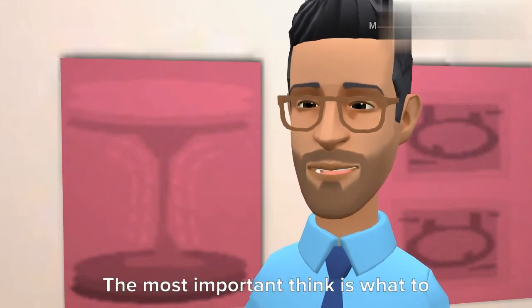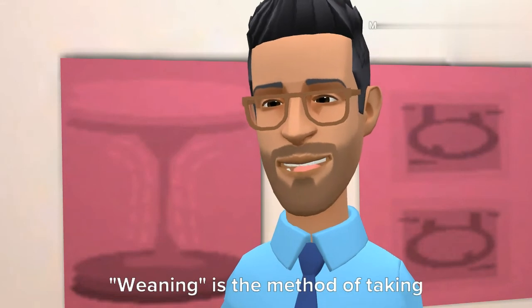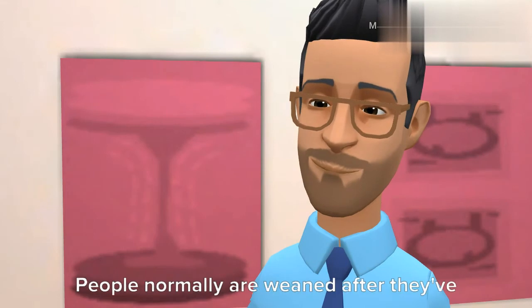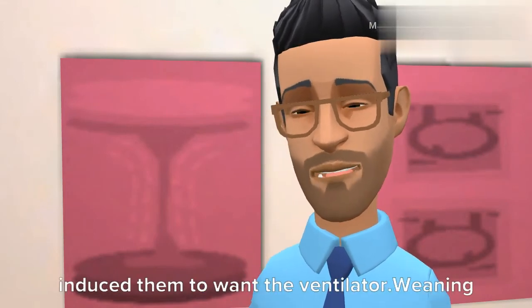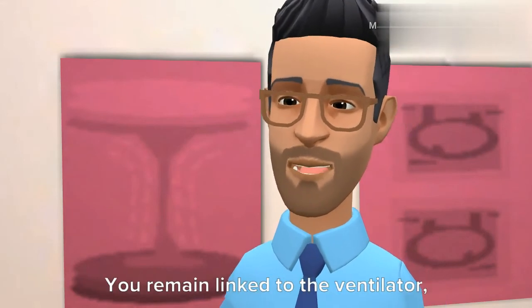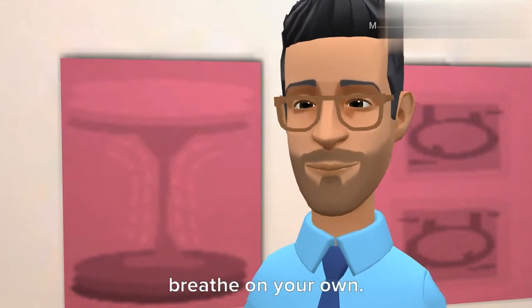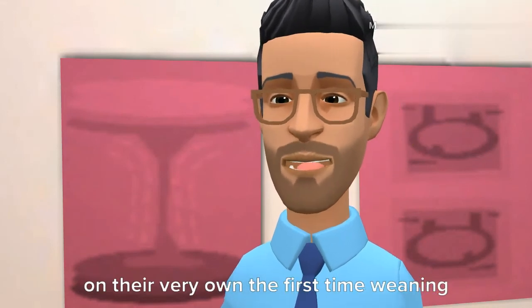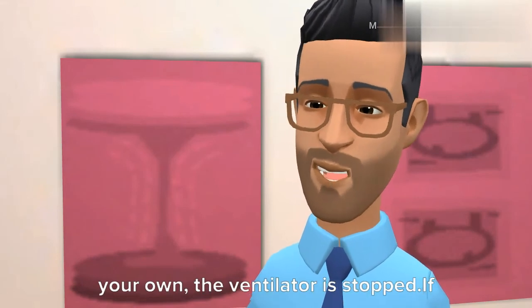The most important thing is what to expect when you are taken off of a ventilator. Weaning is the process of taking you off of a ventilator so that you can begin to breathe on your own. People usually are weaned after they've recovered enough from the problem that caused them to need the ventilator. Weaning usually starts with a short trial. You remain connected to the ventilator, but you are given a chance to breathe on your own. Most people are able to breathe on their own the first time weaning is tried. Once you can safely breathe on your own, the ventilator is stopped.